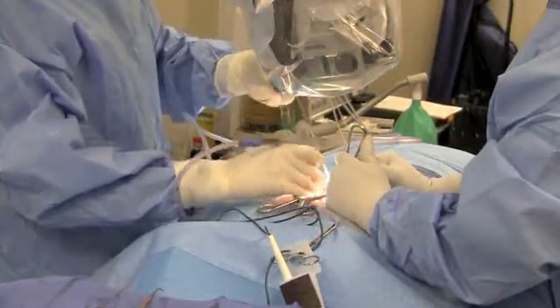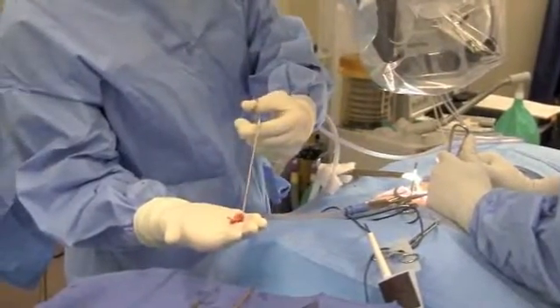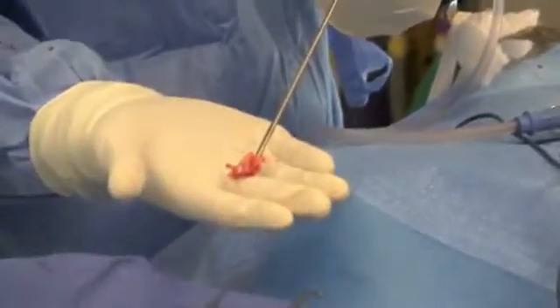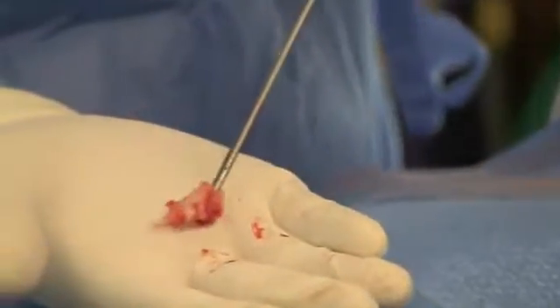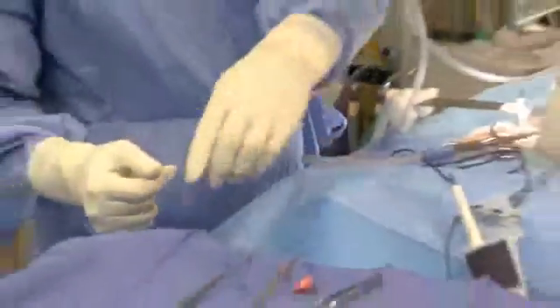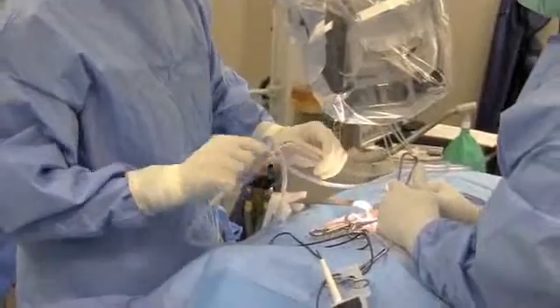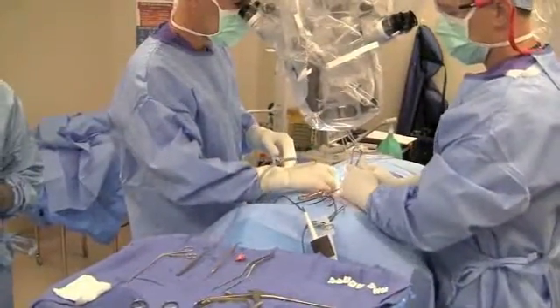Here's the piece of disc coming out. It's a moderate size disc herniation. This has the consistency of crab meat. It was pressing on the nerve. We've removed that now so that hopefully this will improve the patient's leg pain. We're going to go ahead and close things up now and hopefully the patient will be able to go home in a couple of hours.